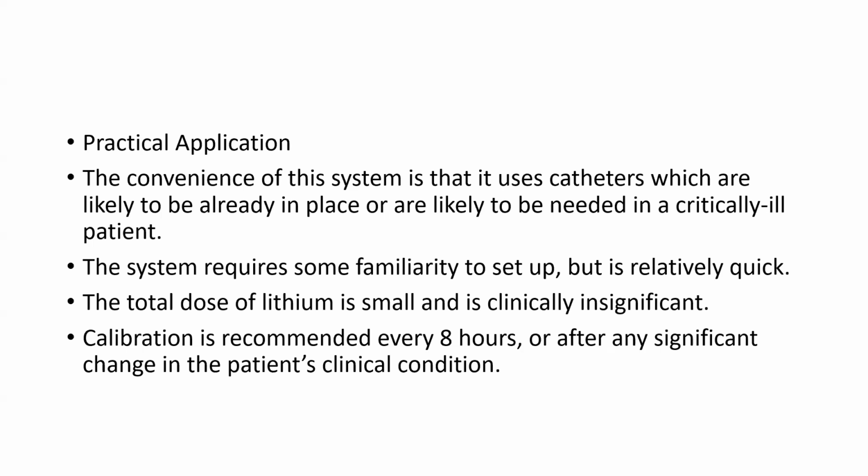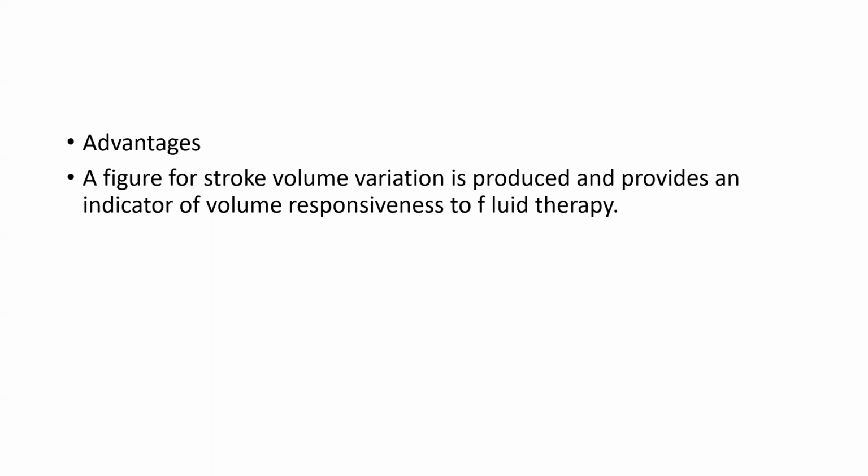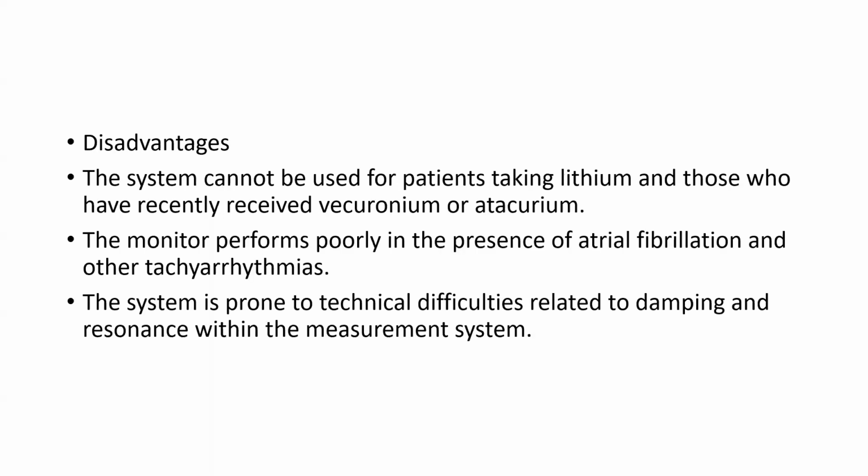The system requires some familiarity to set up and is relatively quick. The total dose of lithium is small and is not clinically significant. Calibration is recommended every 8 hours or after any significant change in the patient's clinical condition. Advantage: a figure for stroke volume variation is produced and provides an indicator of volume responsiveness to fluid therapy.